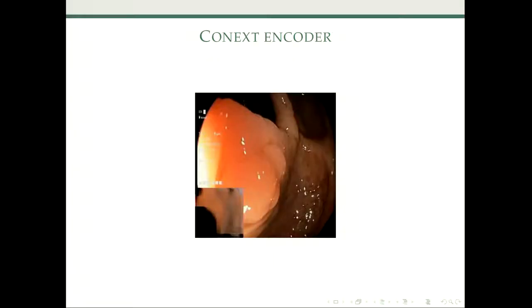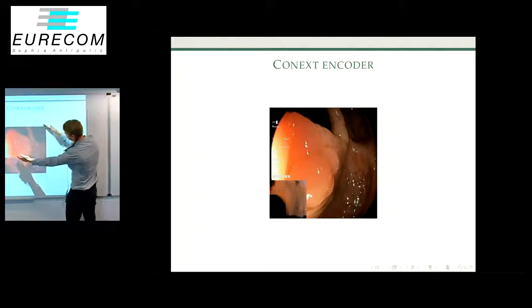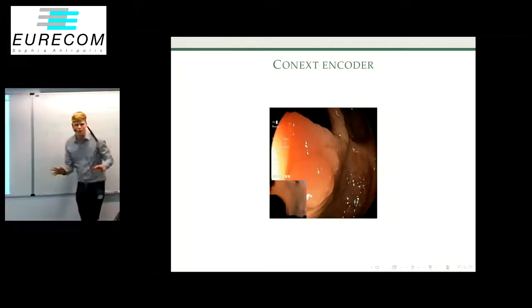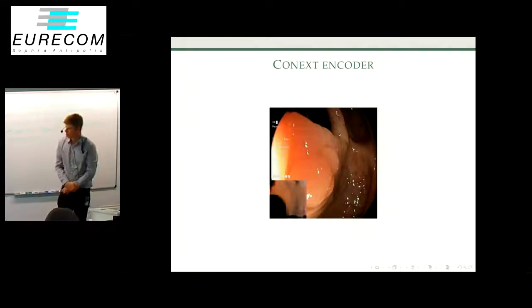We also had a cropped image where we just cut the image and only took this part of the image. So we just removed the area that would have had a green square, and that was our 5 methods that we wanted to submit.